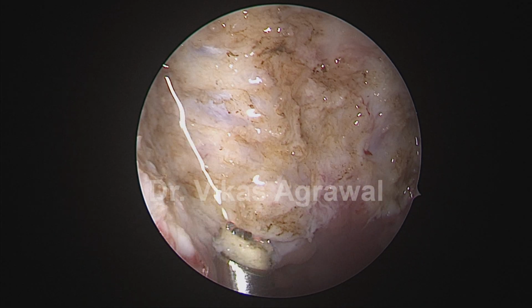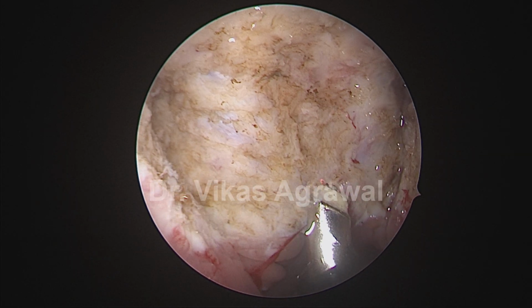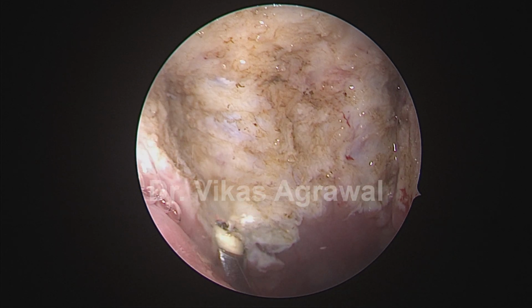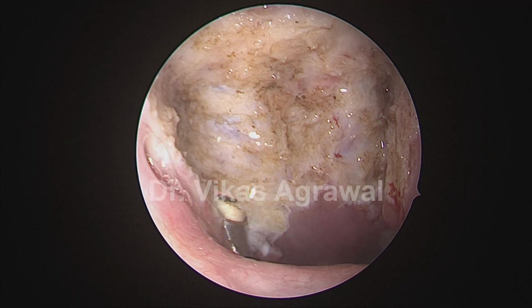Every bit of lymphoid tissue has been taken care of without opening up the fascia.